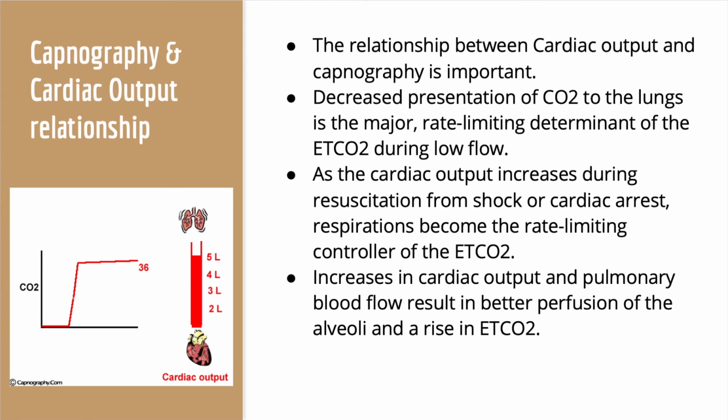Something that I also wanted to talk about was how capnography and cardiac output correlate with one another. It's very important how these two correlate. That's why capnography is so important during codes. Capnography has a ventilatory and circulatory component. The exhaled CO2 depends on the adequacy of circulation to the lungs, which provides clues about circulation from the rest of the body. So low end-tidal can indicate shock, poor systemic perfusion.